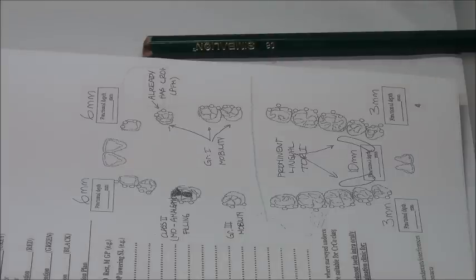And if I can remove that crown and send it to the lab, I reglaze over it. I do something called glazing, putting a layer of glass on the surface. It's low fusing porcelain on the surface, so it fills in all of the roughness left from my preparation. So can I prepare on them? Yes, but with very strict rules. If I find that while preparing I reach the metal, then I go back to the surveyed crown and I do a surveyed crown. Okay? So that's the condition for crowns.